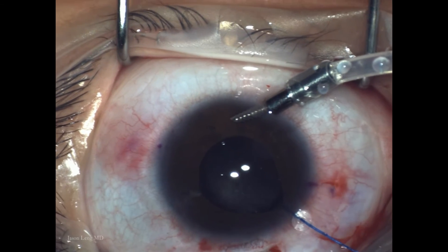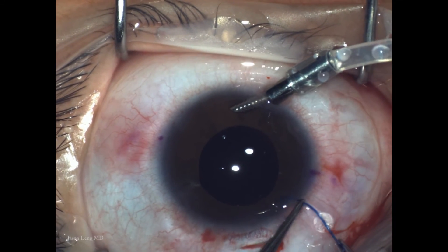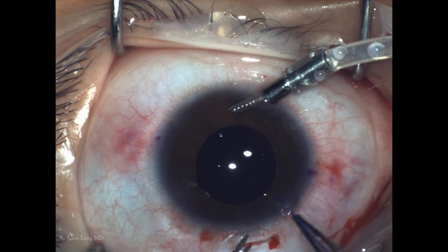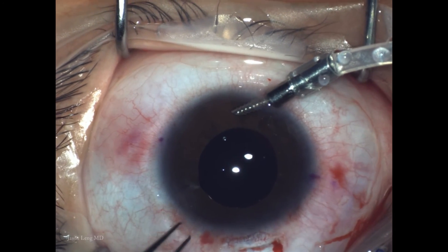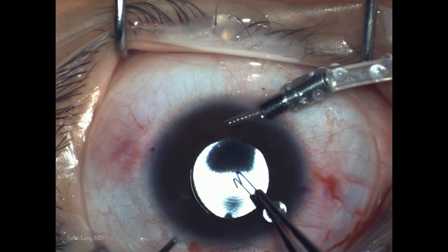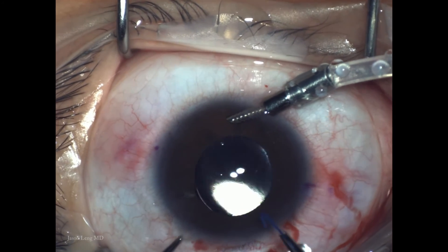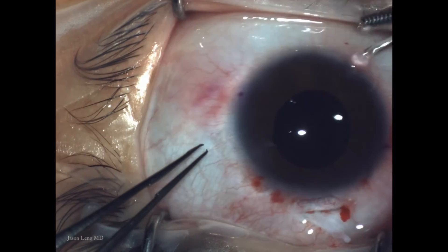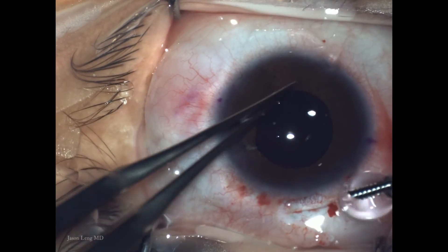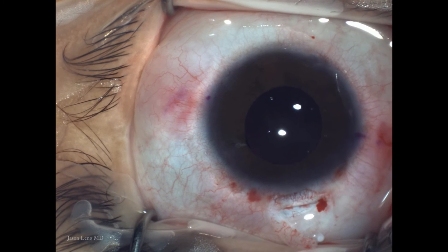If your initial needle passes are exactly 180 degrees apart and symmetrical entering at about 30 degrees, the IOL should be very centered and secure. I removed the iris hook and checked centration — I'm pretty satisfied. Occasionally the IOL won't be perfectly centered, and in upcoming videos I'll show techniques for adjusting centration.